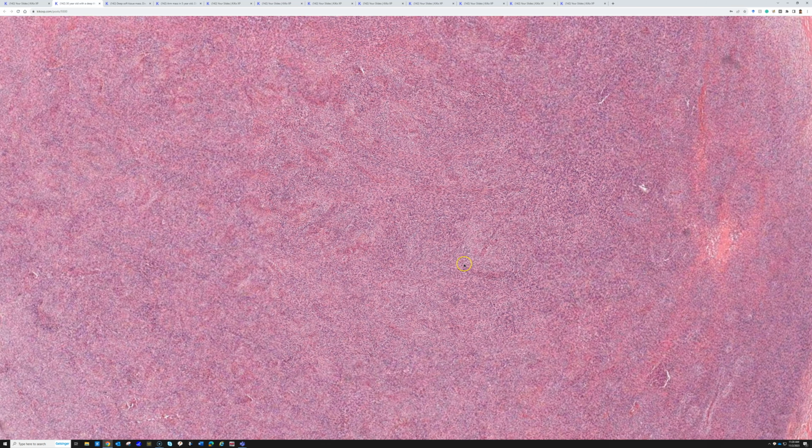So these are actually lipoblasts here. And the lipoblast, both in myxoid liposarcoma and this tumor, by the way, is a benign tumor, lipoblastoma, something I do not see very often, but it's a good thing to know about. The lipoblasts in this tumor, and also in myxoid liposarcoma, are resembling the lipoblasts of fetal fat, the fat that is arising during fetogenesis. That immature fat, that's what this benign tumor is doing.